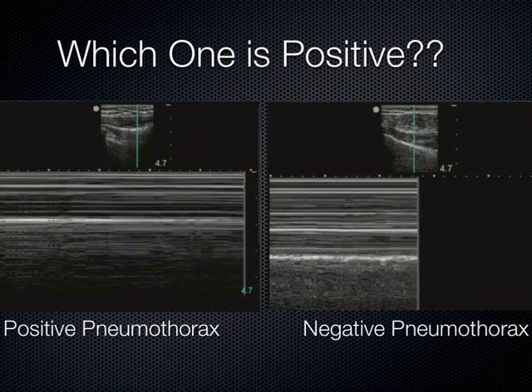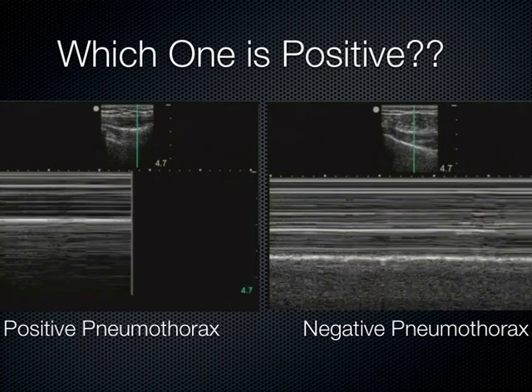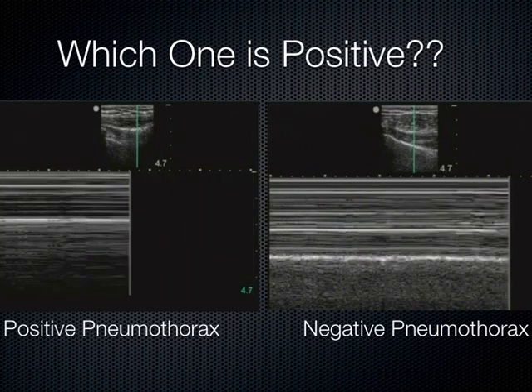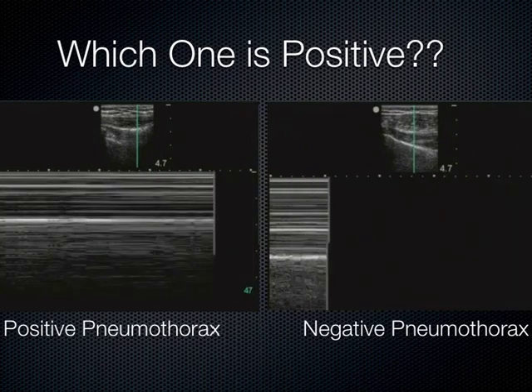Okay. One last thing I'm going to mention that's very specific to pneumothorax and actually is 100% diagnostic if you see it, although you may go your whole career and never see it. If you do, I want you to understand what it is.